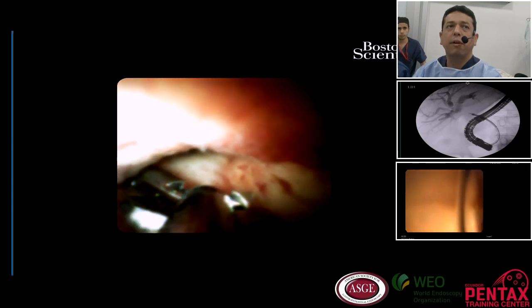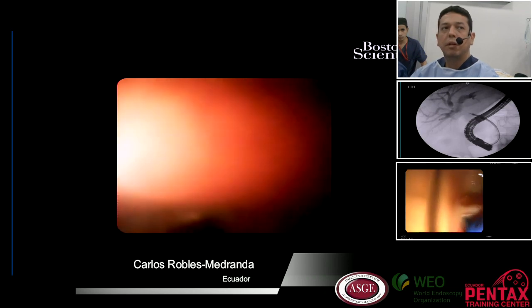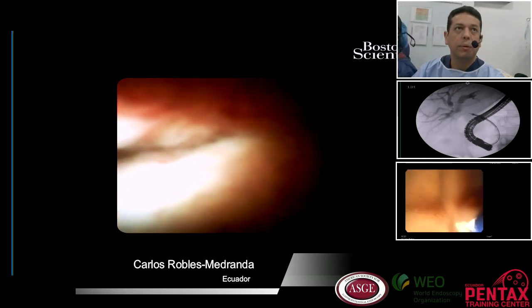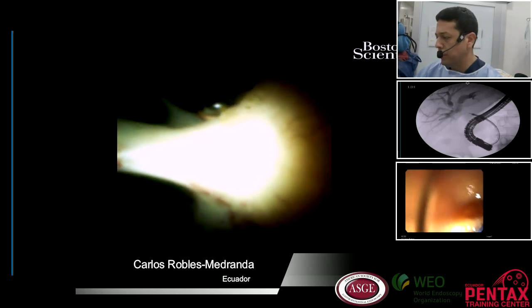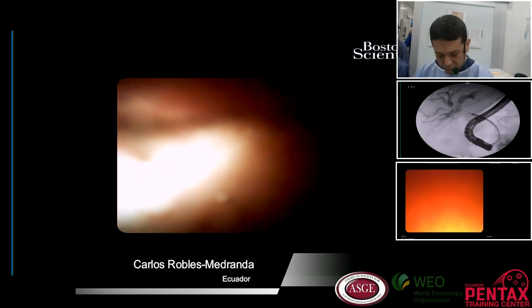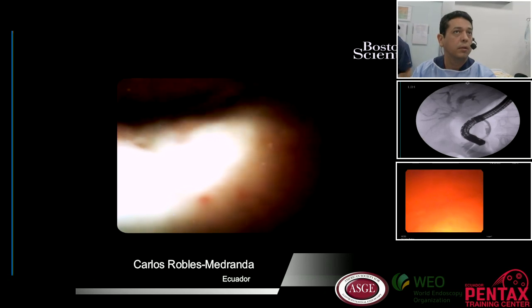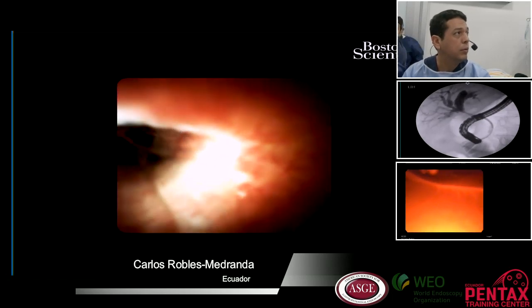I want to take the biopsy from this area. So this is a 5 o'clock area, so it's not so easy, but you need to move your scope a little bit, and okay, cierra. Okay, perfecto. Okay, you need to feel also when the biopsy forceps advance. Okay, I need now to pass contrast. Contraste, por favor. Okay, perfecto. Más contraste. Contraste. Okay, toma foto. Okay, pasa la guía.